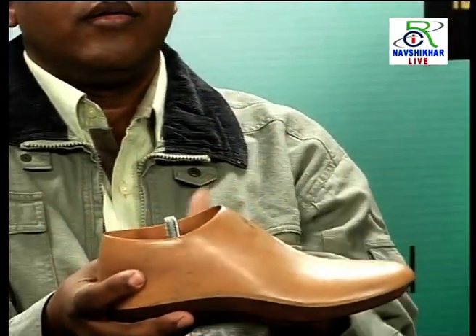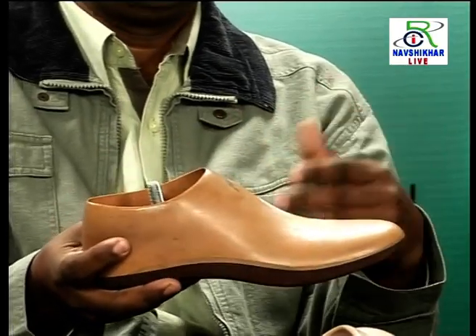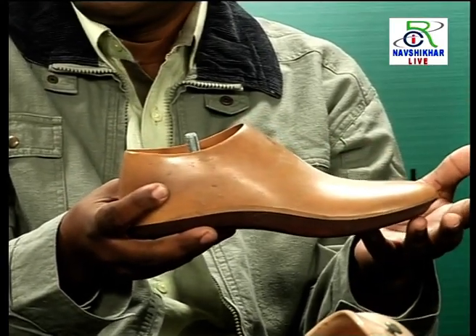But nowadays there are energy saving feet and carbon fiber feet, used by athletes who can run with that kind of foot system. So the cost will also go up, according to the technology. A simple carbon fiber foot will cost you around 2 to 3 lakh rupees, just for the foot piece.